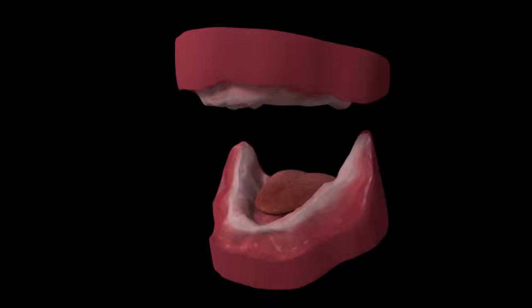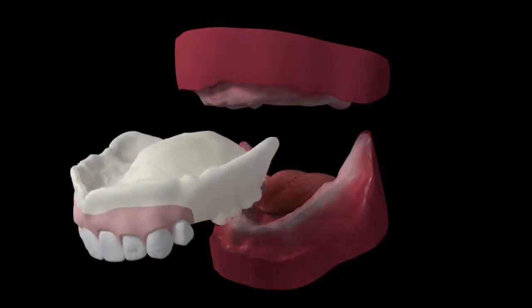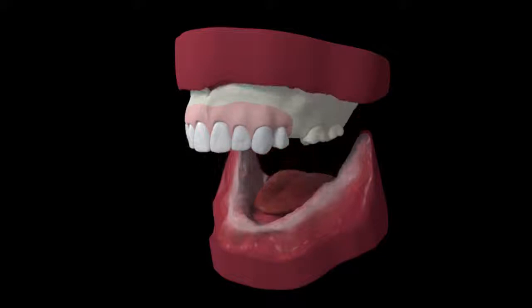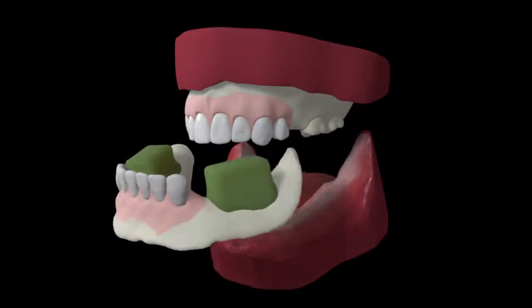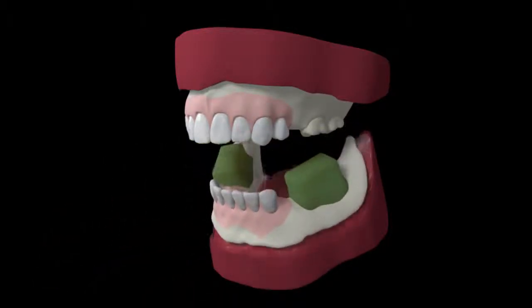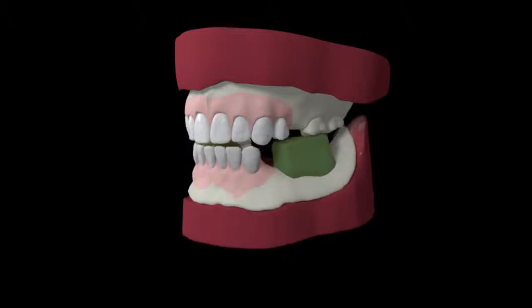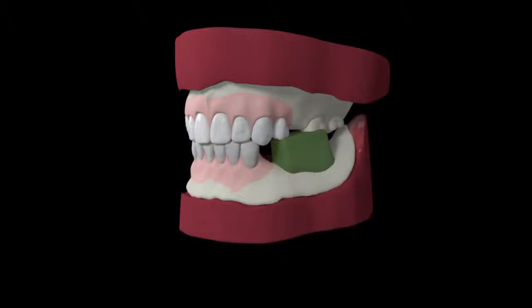The guides are now ready to be adjusted in the patient's mouth. Since the guides are fabricated using the final impressions and are milled with evident milling technology, they offer a perfect fit when placed in the patient's mouth. They are extremely stable and therefore allow the dentist to obtain accurate records.